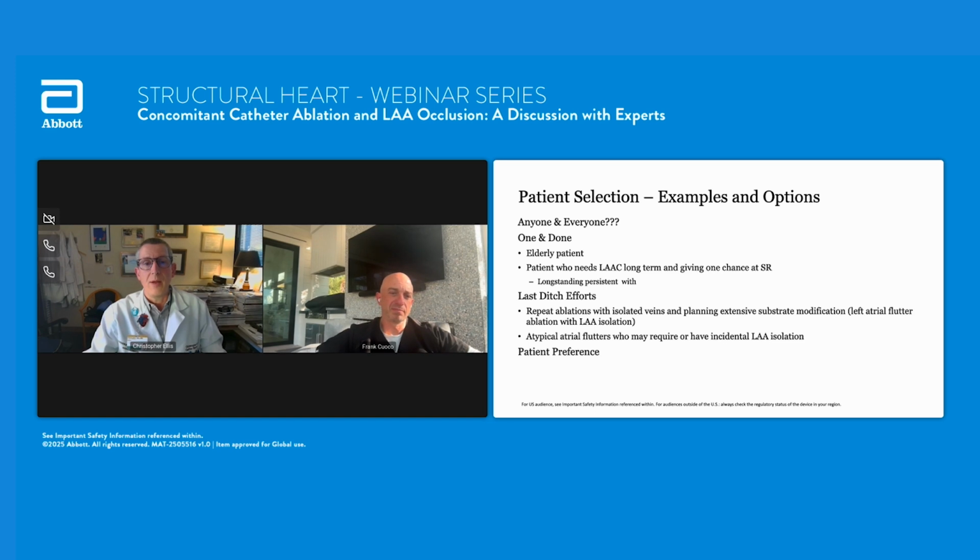But I want to see OCEAN, some of the other trials on ILR monitoring and PRN DOAC, and see, are we necessarily, like the CHA2DS2-VASc 2 and 3 patient, are they really better off with a device in the appendage or just waiting until they recur to make a decision on it? It's a tough call. We don't really know the answer to that, but I certainly think most of my CHA2DS2-VASc 5 or higher patients, I would offer concomitant, to the points that you just made.